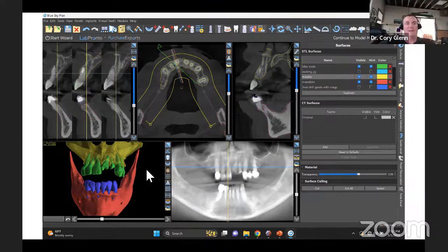But honestly, when we've done things for, sometimes for products that we're bringing through FDA, we have to prove the accuracy of them in their printed form as opposed to their digital form. So imagine ortho trays. This is a project I had to do. We generated ortho trays for clear aligners, right? But then you actually have to print those in this material. And the FDA wants to know, is the 3D print that you're getting actually true to the digital file you designed?